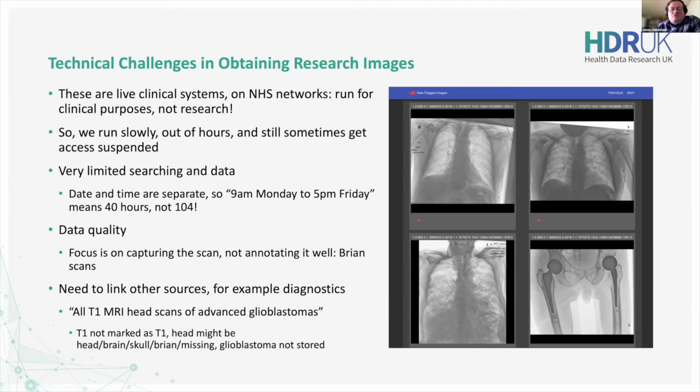So we have a scary number of "Brian" scans where you're actually looking for a brain scan, which is one of the many details that doesn't matter clinically. If a doctor is looking at a patient with a head injury and they're handed a scan of the patient's "Brian", they don't care. They just look at the content. But of course, as soon as you're trying to index and search this, even a little typo like that can be a barrier, because of course a search for brain won't match that string. They're different words, which of course makes indexing this data for research purposes more difficult. It's also a problem when you're scanning for identifiable data. I'll mention that in a moment.